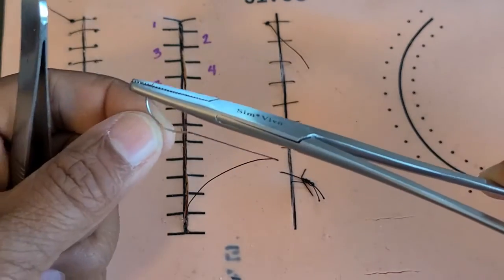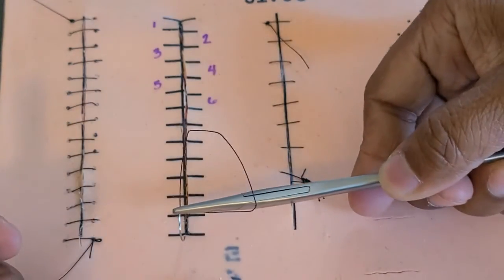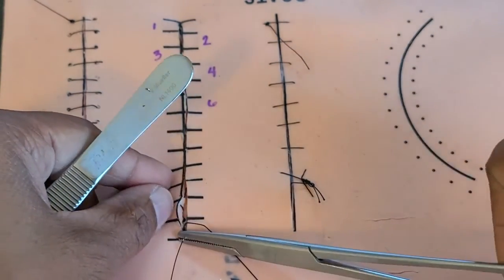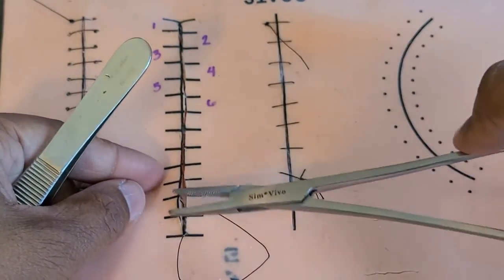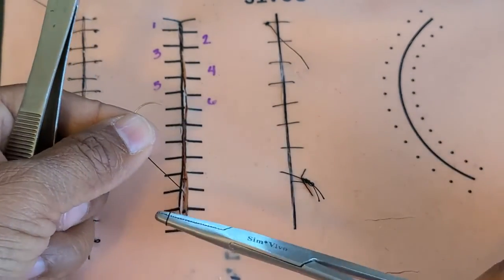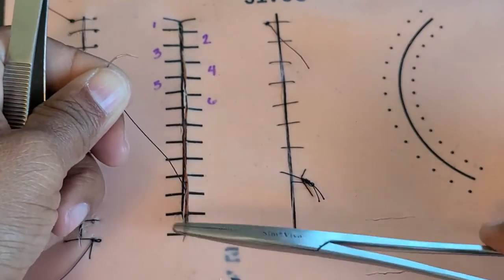I made a mistake there because my suture is actually a little too short. So you're going to go through your epidermis and you're going to end up in the middle of your incision. You want to make sure that you leave a loop. This loop is what you're going to use to tie.